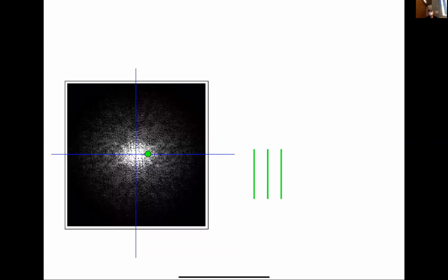So if I pick a point along the Kx axis and ask what that point in K-space corresponds to, we just said that it corresponds to variations that only vary in the x direction. So it would look like some variation here. And if we go farther out along the Kx axis, then that's at a higher spatial frequency, so the spatial period has to be smaller, and that's going to correspond to something like this.